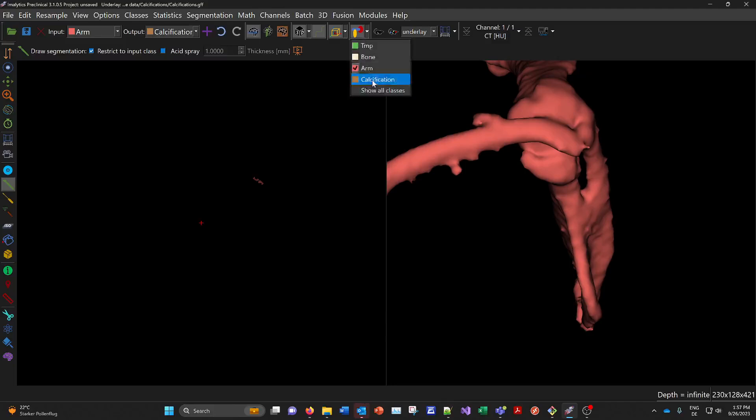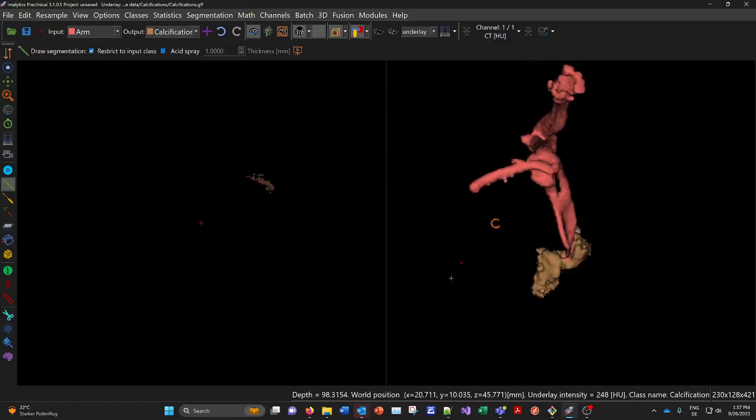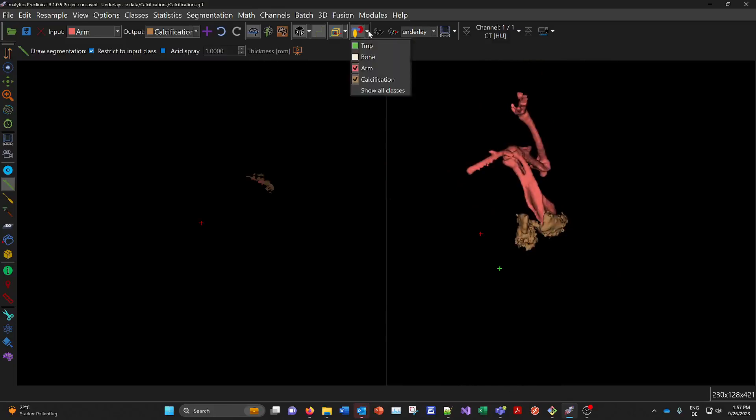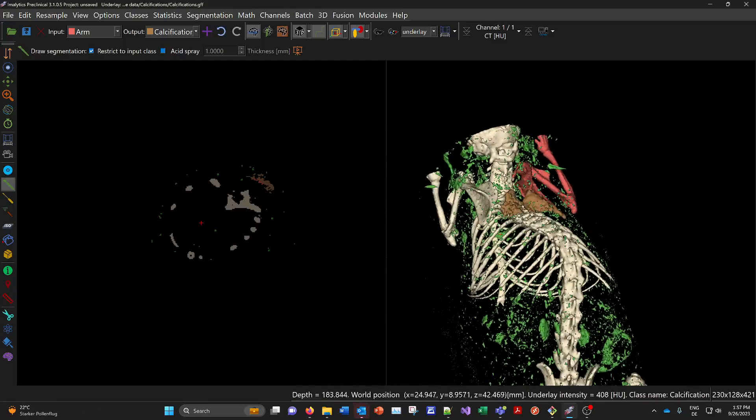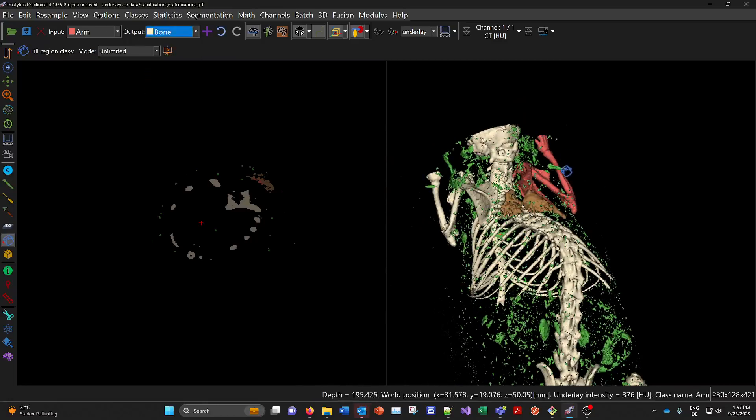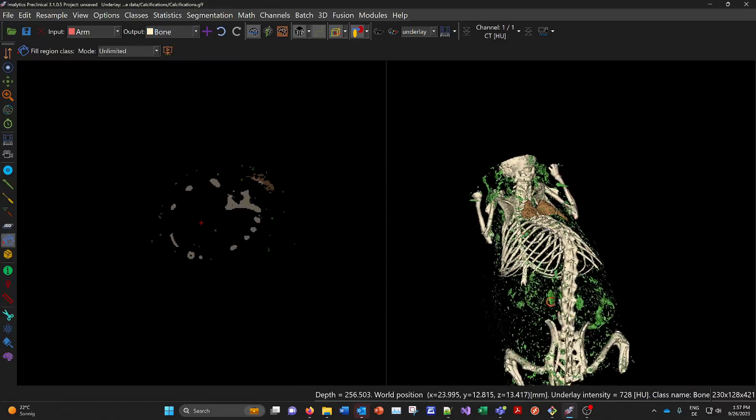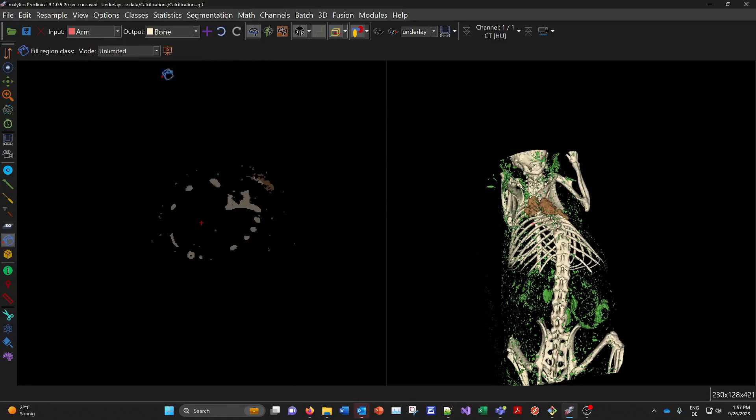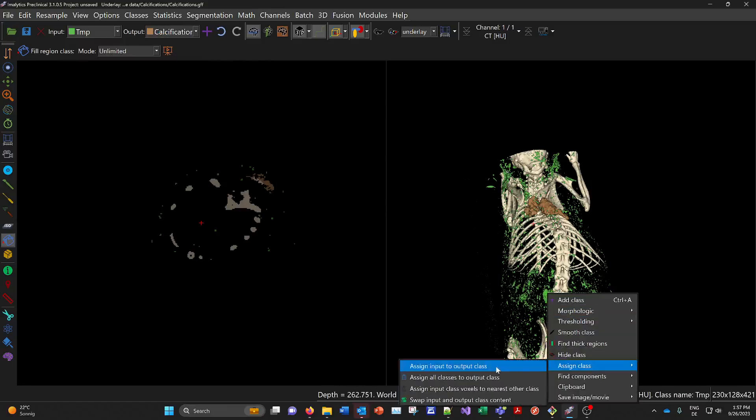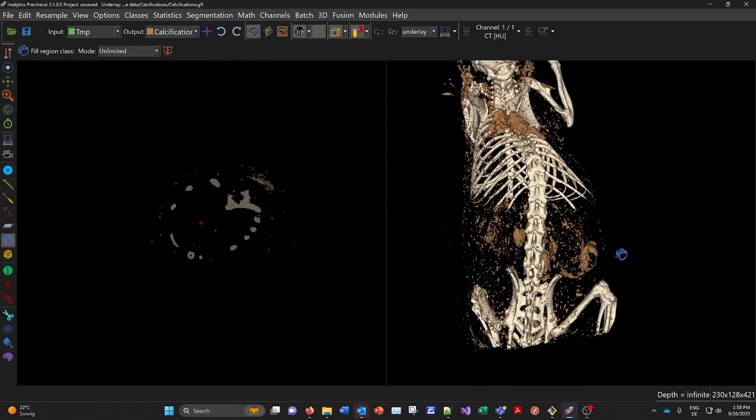So now we have these guys here. And now we can show the other classes again. And we can move the arm back to bone. And we can assign all the small guys here, the green guys to calcification here. Now we have the calcification segmented.